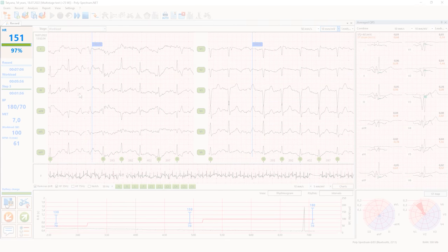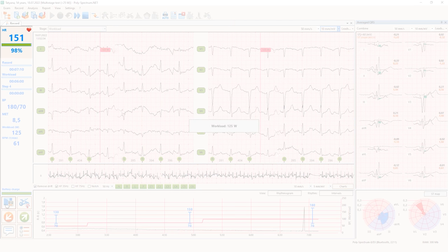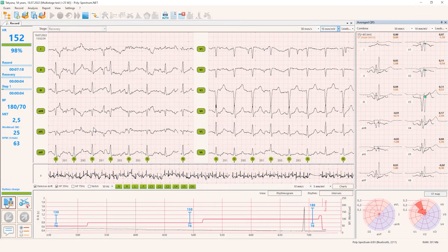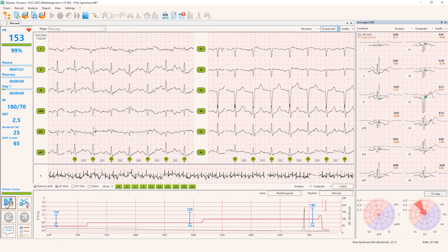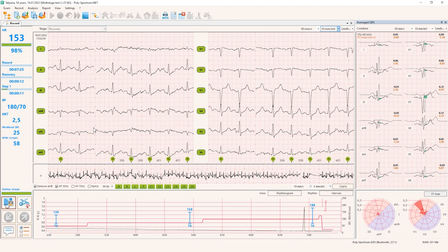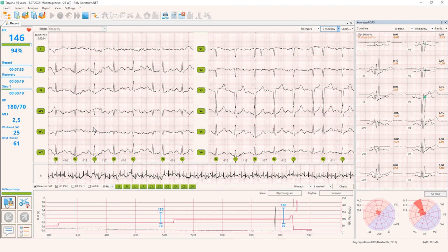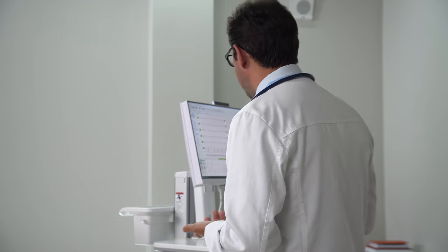So we have now exercised 97 or 98% of the pre-calculated, and I can stop the test now and go to recovery. When you start thinking about termination of the test, actually, we have two situations. You achieved some goals, that predetermined goal of the test, or you achieve some clinical outcome. In this case, we don't have any clinical outcomes because no pain, no fatigue, or no signs of positive test or some feature that can tell us that, yes, there are problems with the heart in this particular patient. So we go to another reasons, like our goals.